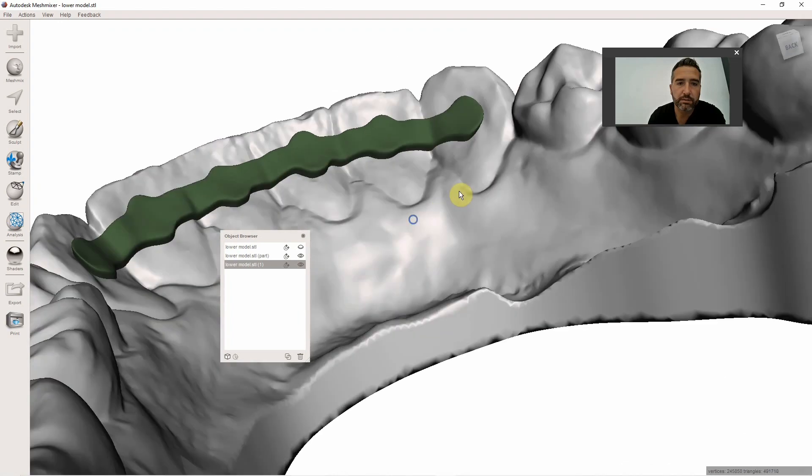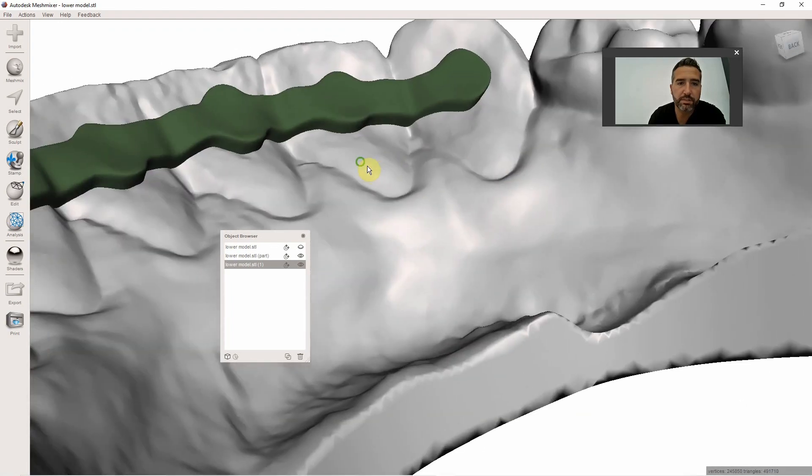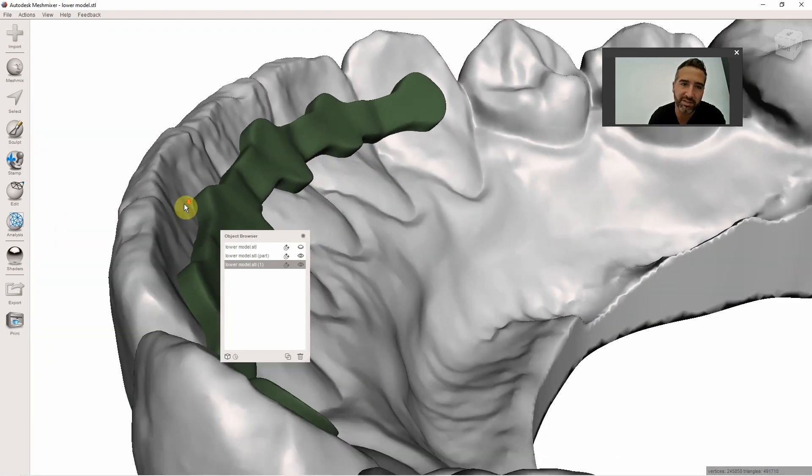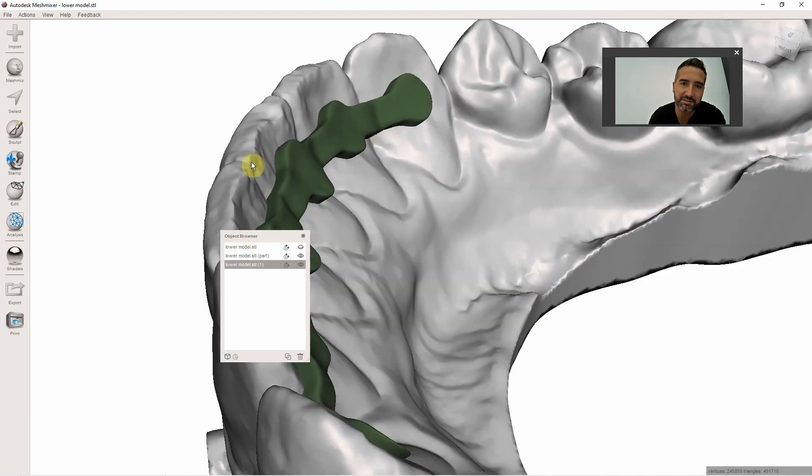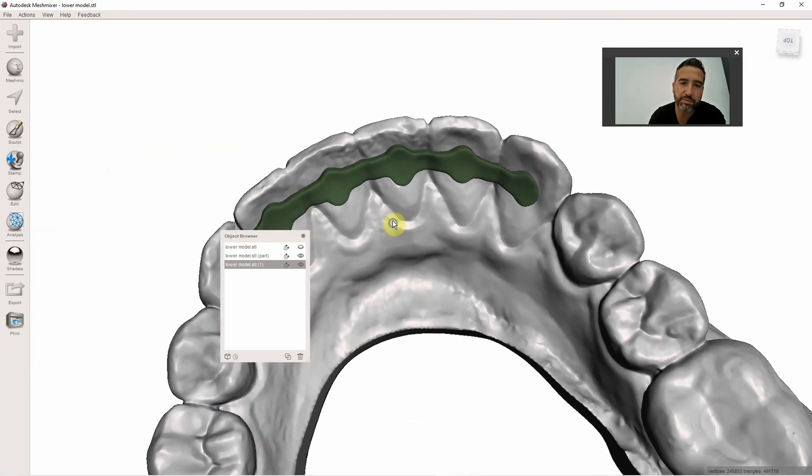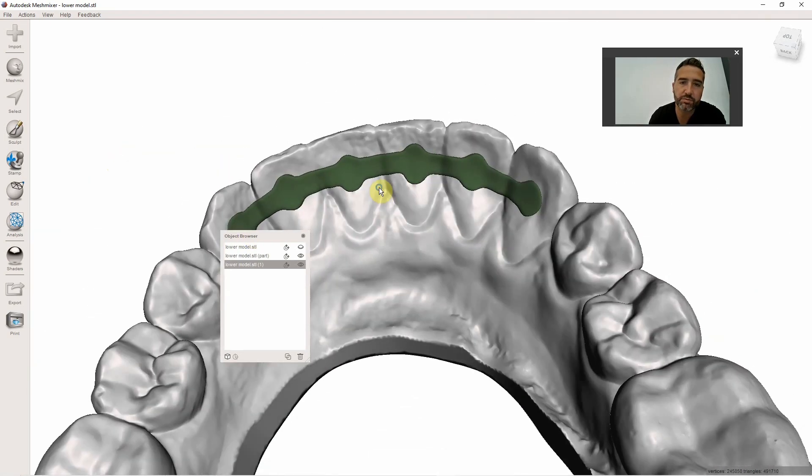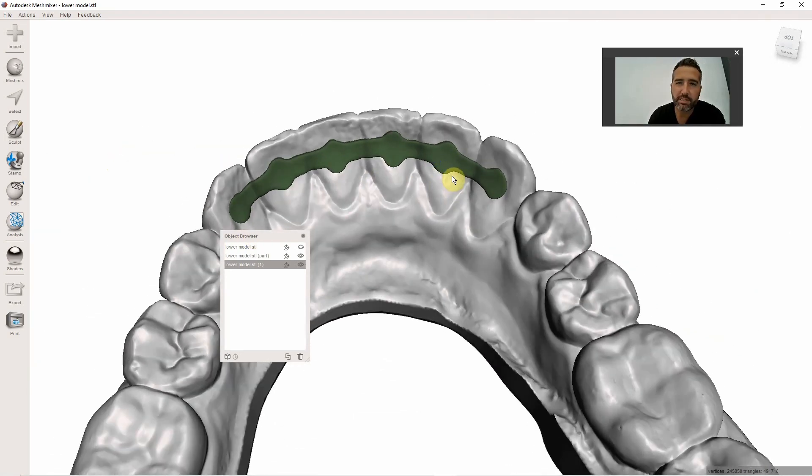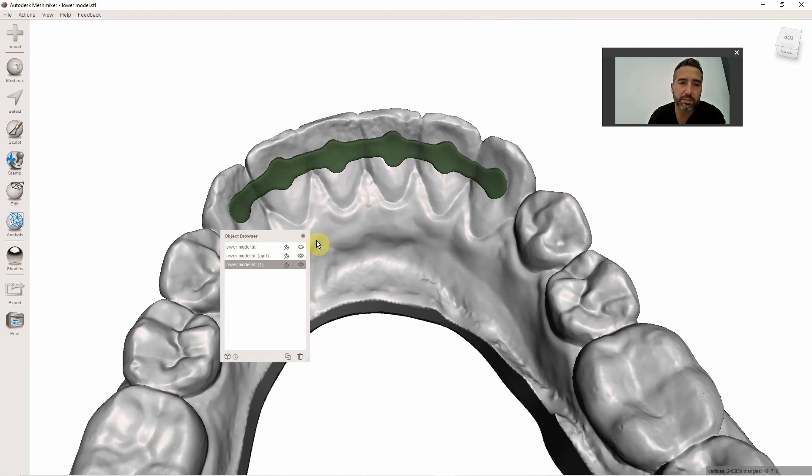And it looks really thick and bulky here, but it is paper thin. These things are super comfortable for the patient. They're smooth, better than a titanium wire in my opinion.